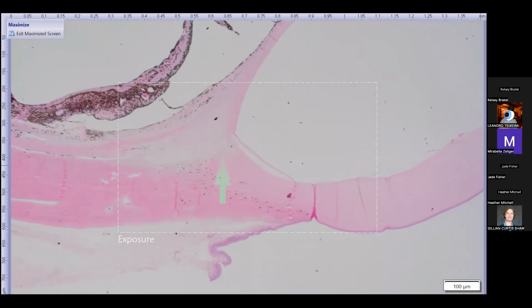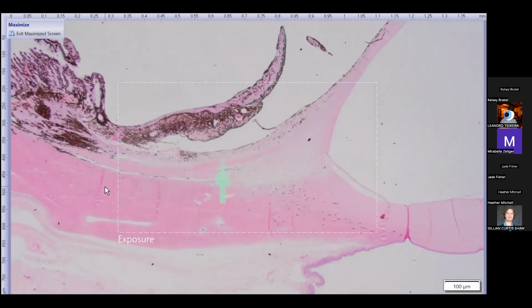And then while we're over here, before we move too much further away, the conjunctival fornix is way up here. You can follow the limbus here. So this is the deep corneal stroma. This is the scleral collagen. You can see the slight difference in staining in those different collagens and the melanocytes that kind of mark where the limbus is at. And the iris base, however, is way back here. So that's an angle recession, and or this is a consequence of the cyclodialysis, and it healed kind of funny back into place, not in its normal anatomic location. So just a walk through how distorted trauma has made the anterior uvea.